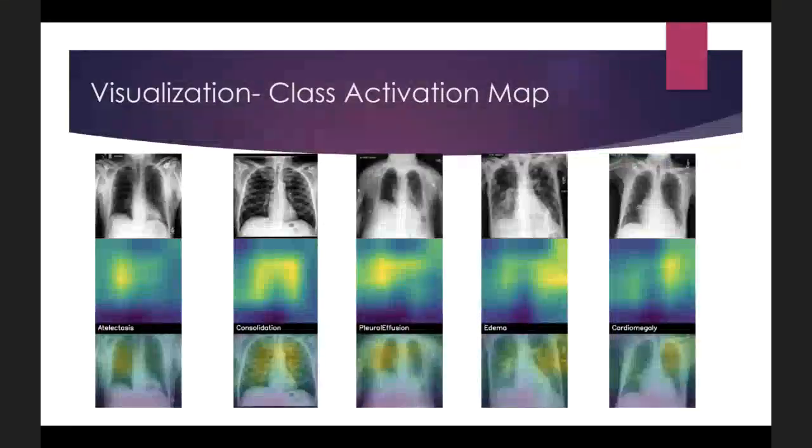All right, for visualization, we use Grad-CAM to accurately pinpoint the pixels which contributed the most towards the classification of a pathology. We have described our process, and here is one example of Grad-CAM. Can you please go to the next slide?